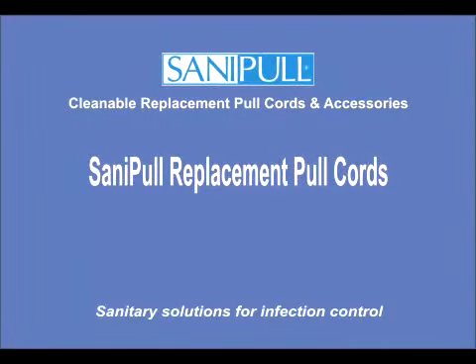SaniPull cleanable replacement pull cords and accessories have revolutionised hospital practice in terms of infection control around patient touch points such as nurse call stations, bed head pendants and equipment fixing.